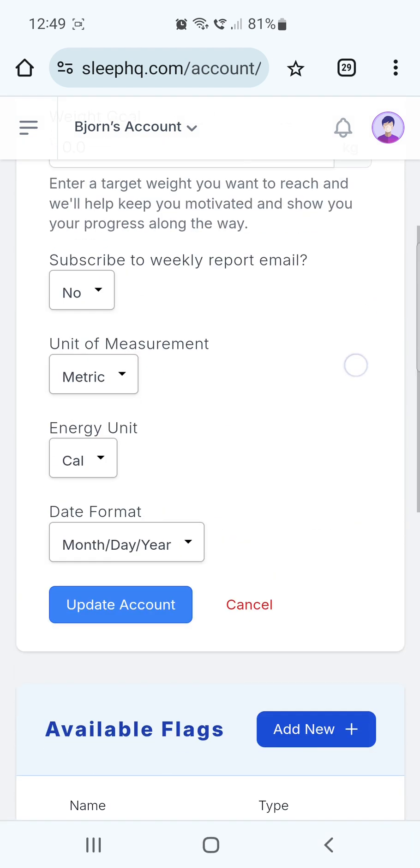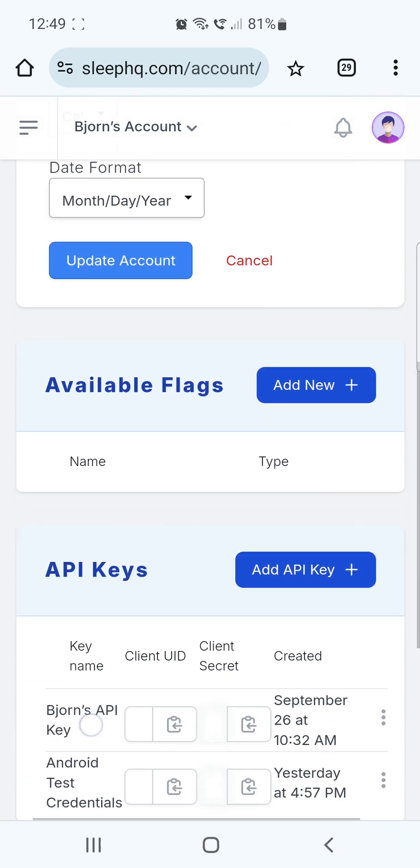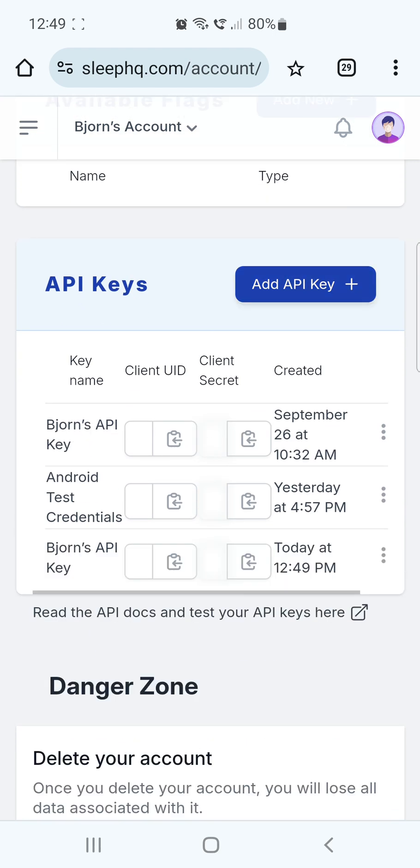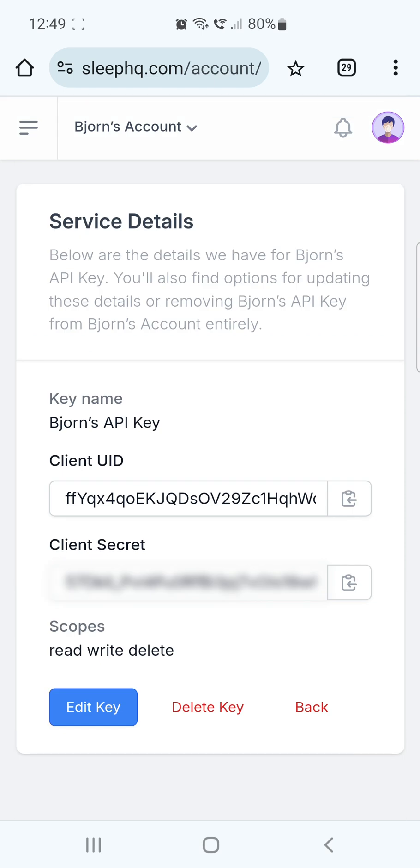Scroll down to the API Keys section and tap on the blue Add API Key button. To make the API credentials visible, tap on the API key name at the beginning of the line. You'll see both the client ID and the client secret that we need for the Android app.